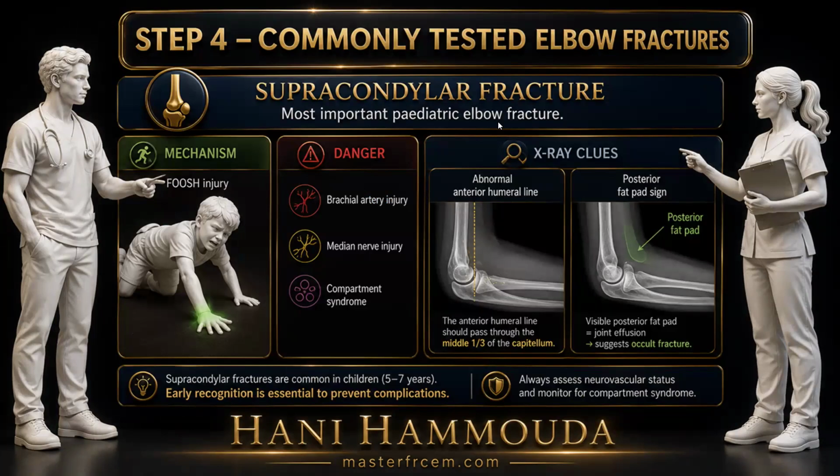Okay, commonly tested elbow fractures. So check the mechanism.